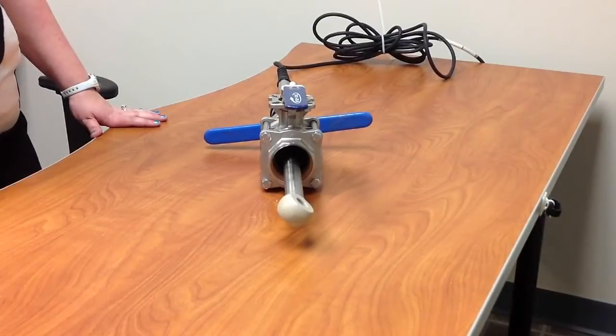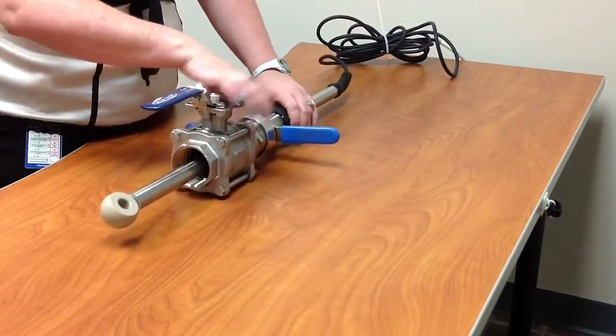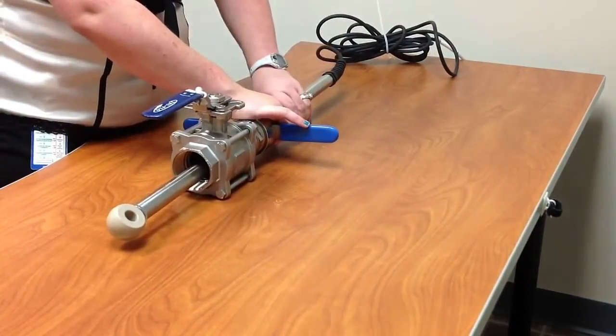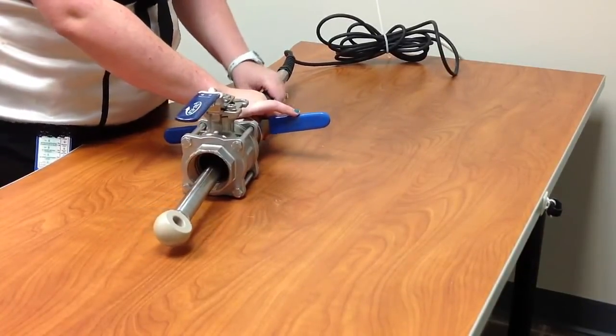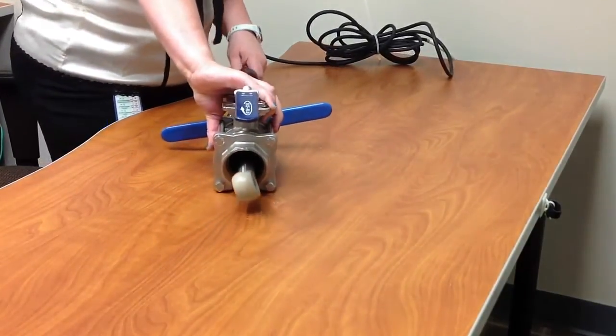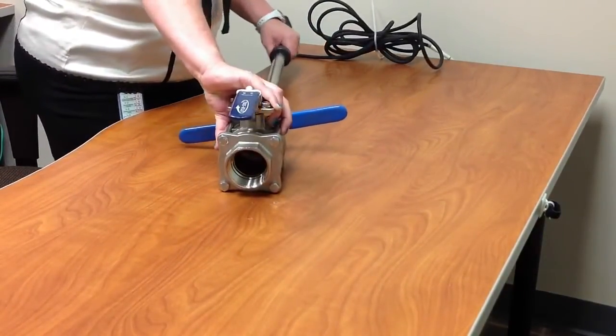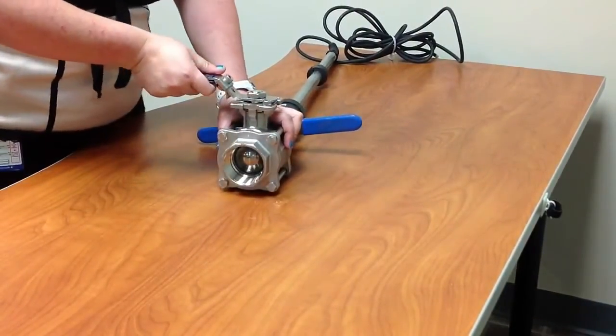Now we're going to go over the basic steps for extraction from the process. The first thing you do is the locking nut, you'll actually unloosen it so that you can pull out the PR-10 as far as you possibly can. Then you'll be able to pull the PR-10 body into the ball valve until you can't go any further. Then you're going to turn off your ball valve.